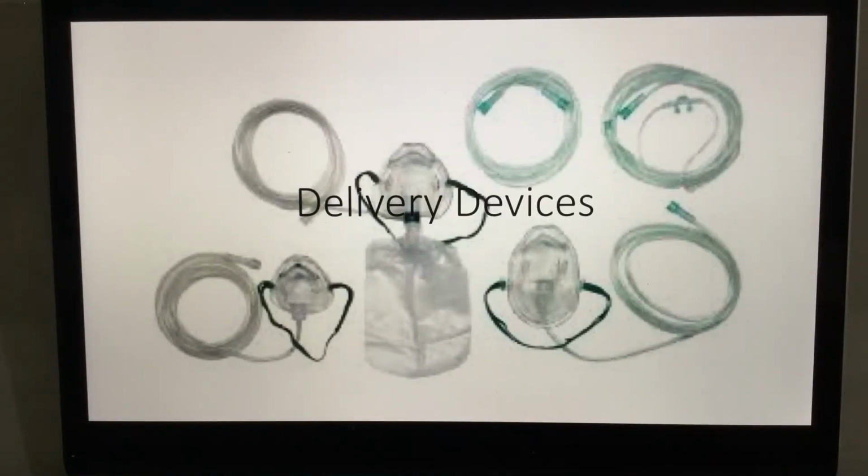Delivering oxygen requires us to now have an oxygen tank and regulator assembly that is ready to deliver oxygen. Now, to get the oxygen from that tank to a patient requires us to decide what delivery device we are going to use. Here on your video slide shows a few different devices. As we go through it, on the right topmost corner of this video slide is what looks to be a nasal cannula or nasal prongs.